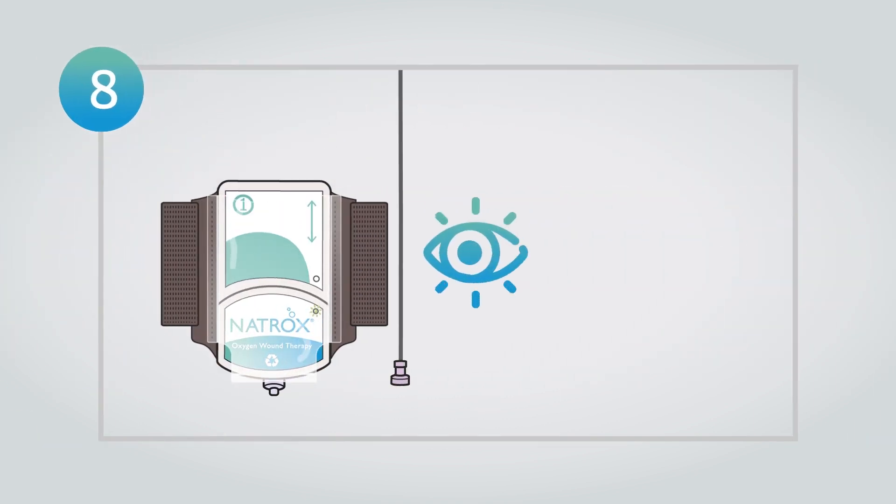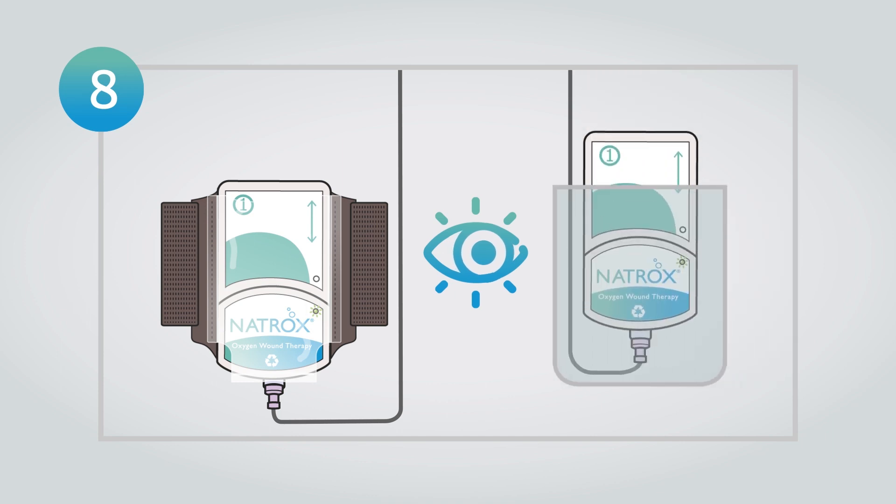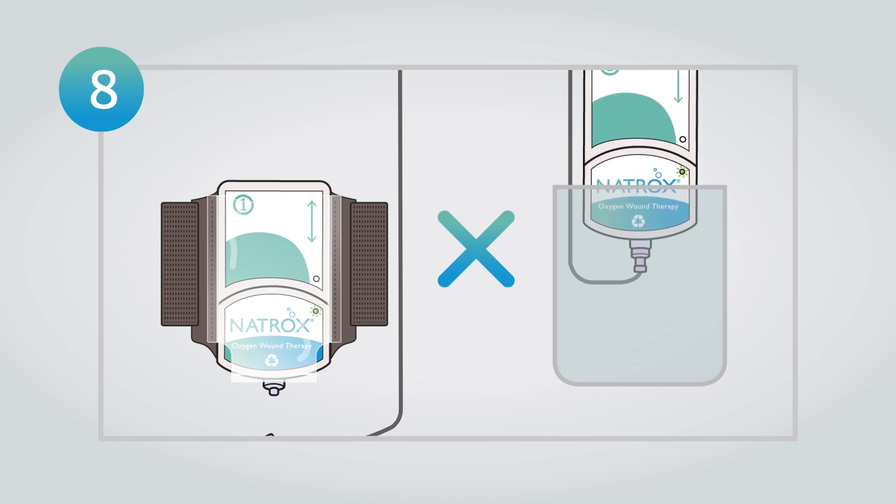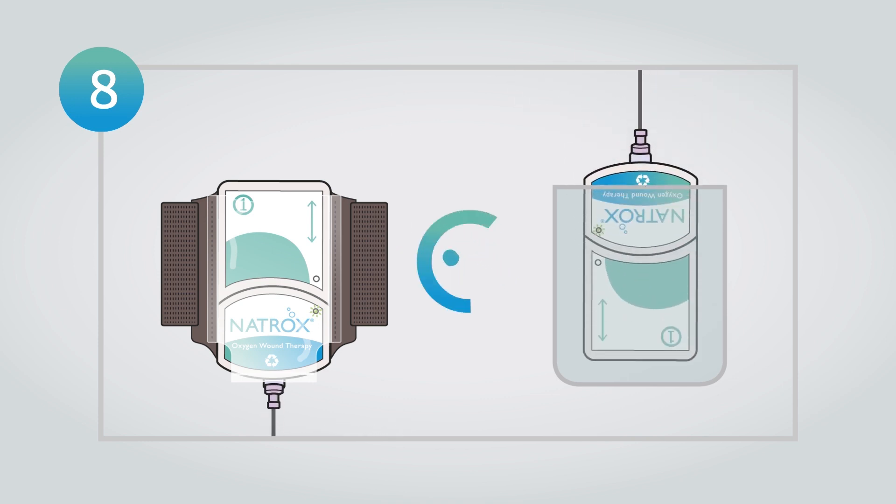Position the OG either in the holster provided or where the user finds it most comfortable. Care should be taken that the device is not positioned in such a way that the tubing is bent or distorted.